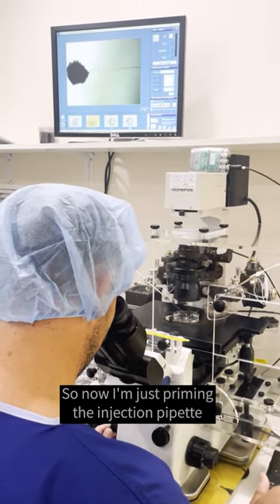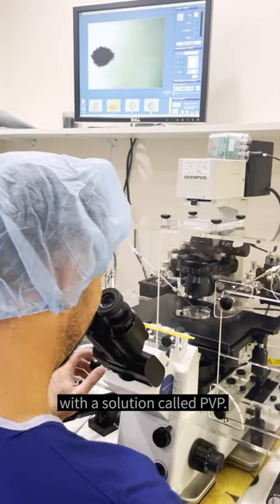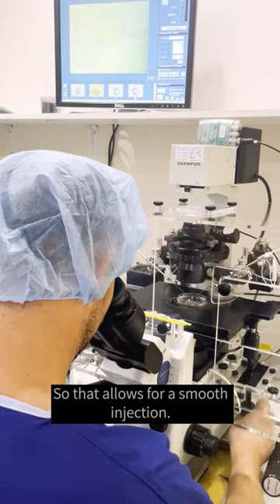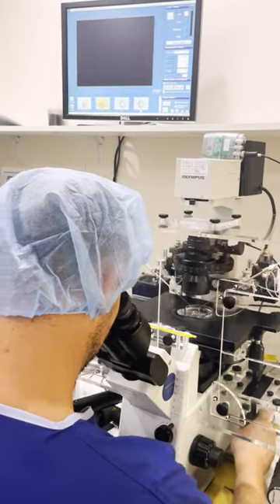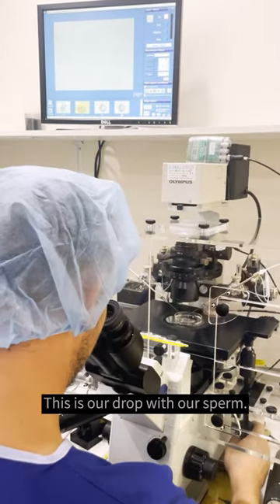So now I'm just priming the injection pipette with a solution — PVP — so that allows for a smooth injection. And this is our drop with our sperm.